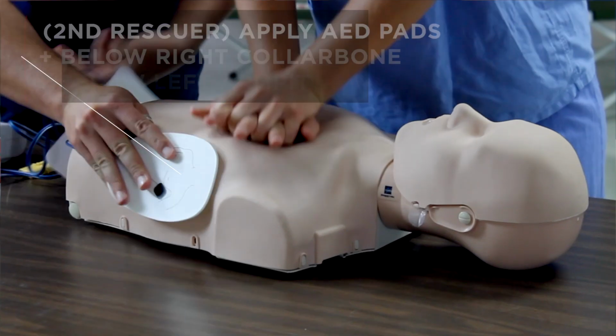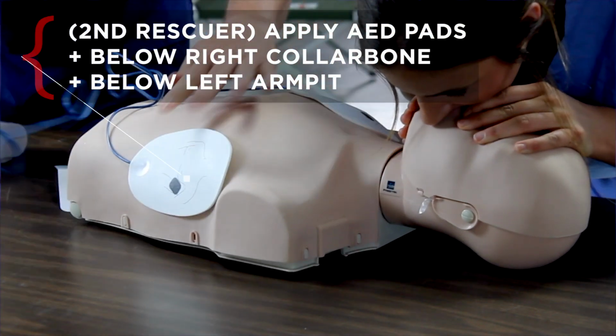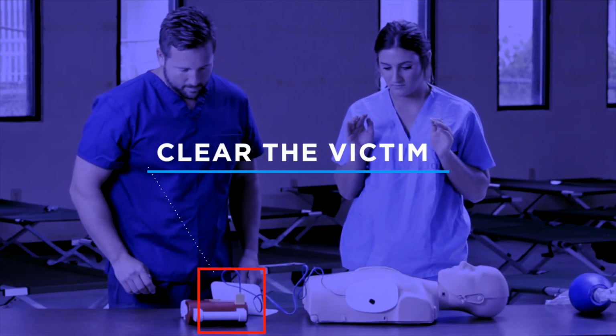any clothing from the victim, and apply the AED pads, one below the right collarbone and the other to the side of the left nipple below the armpit, while the other rescuer continues performing CPR. Plug in the connector and clear the victim while the AED analyzes the rhythm.